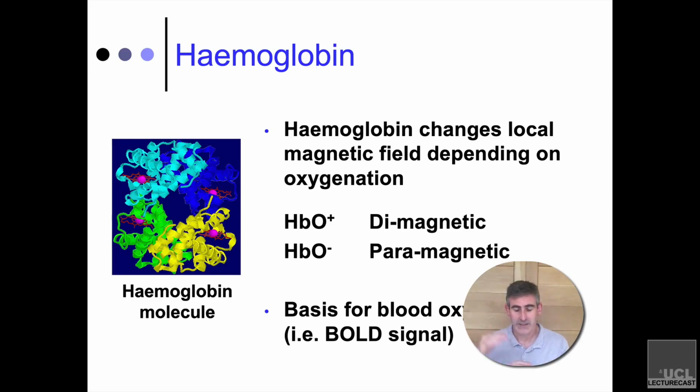So the frequency of the information is something that we can encode using external magnets, but as soon as you put something in the field that distorts the magnetic field, these free iron molecules within hemoglobin, then that changes the signal. It drops it because what it expects is distorted by the fact that there are these little iron molecules interfering with a magnetic field locally. In contrast, when they're covered with oxygen, it doesn't affect it.